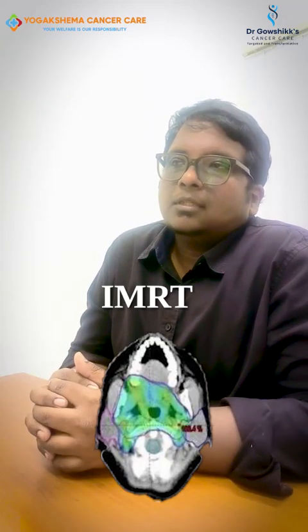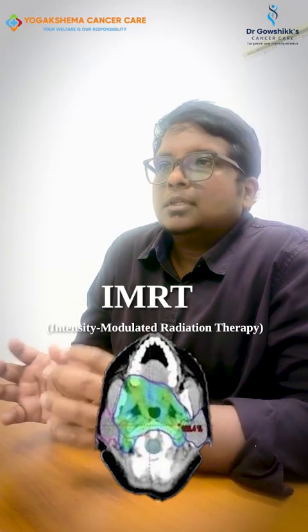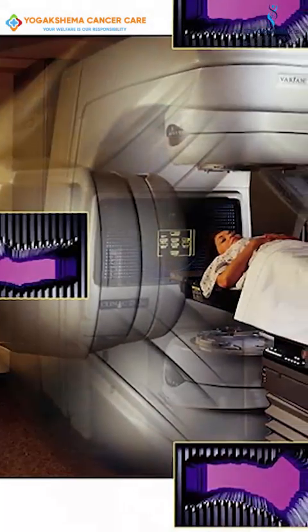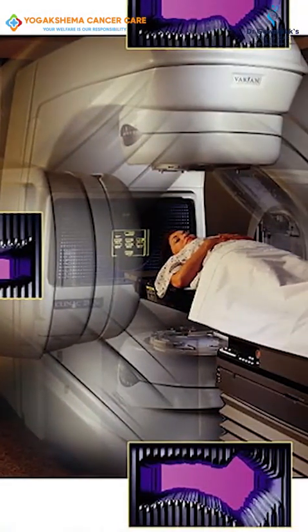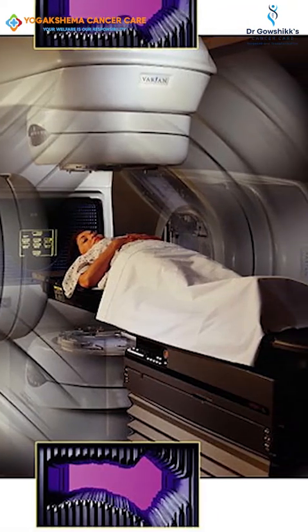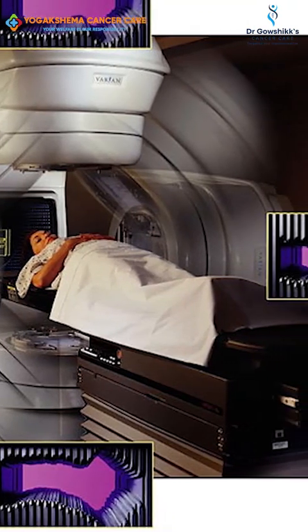Next comes the IMRT. IMRT is nothing but intensity modulated radiation therapy. In this treatment, we use something called intensity modulation. That is, the particular site of the cancer will get a high dose, and the surrounding structures will have a reduced dose. More like if you're setting up or doing a vlog, there will be a focus light on you, a dull light behind you, and some extra colorful light next to you.